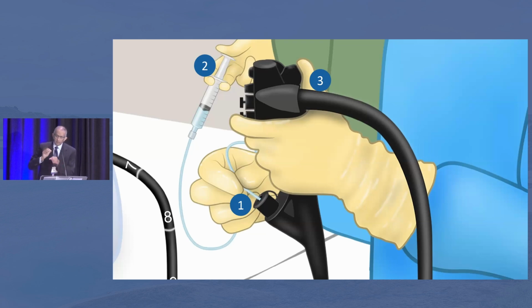One, you have the biopsy port, you have your catheter. I hold it 1 finger breadth away from the biopsy port. That's the amount of distance I hold my catheter, and that's the small movement I do to get into the submucosa. This is true especially in the cecum, when the cecal wall can be just 2 or 3 millimeters when it's distended. So that's a small movement.